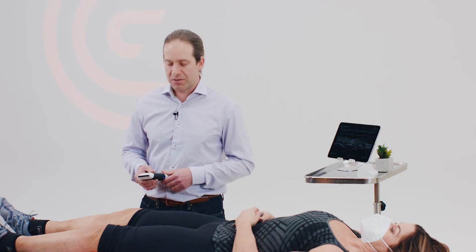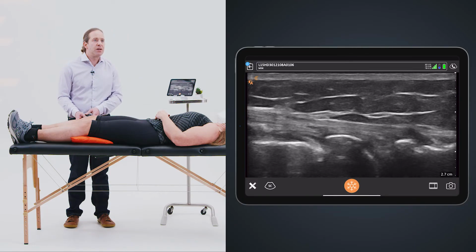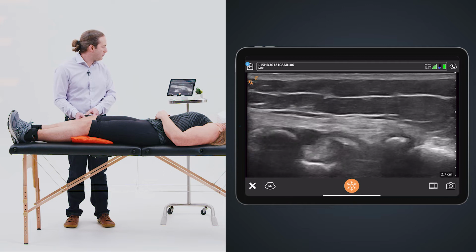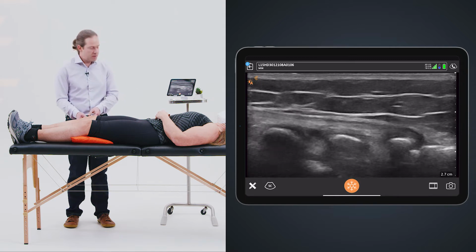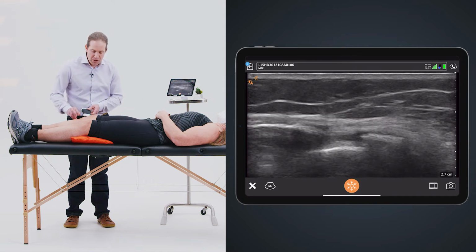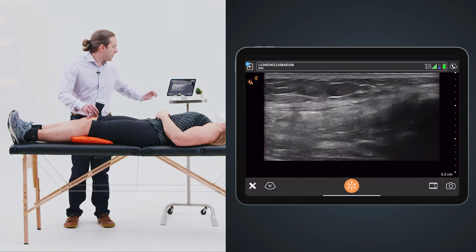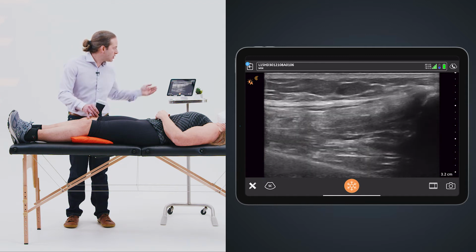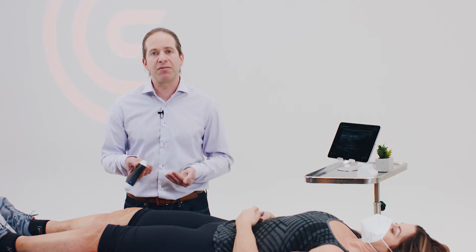In our model here, let's look at the anatomical target we're trying to hit for a common knee injection. When we used to do this blind, we got desensitized to our patients experiencing pain because my needle would have to come in, and I got used to scraping bone or cartilage or some of the other soft tissues. But with ultrasound guidance, we can transition where we do our procedures here to something like the suprapatellar space, where now I can inject directly into a potential space. And I know that an injection should be painless into a potential space because there are no nerves in the joint space itself. If the patient is experiencing pain, it's because I missed.